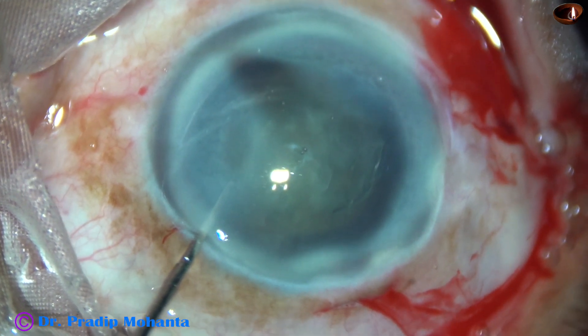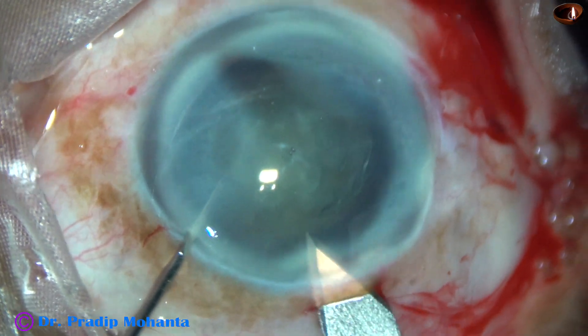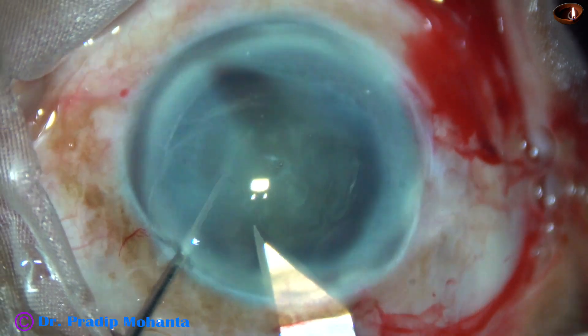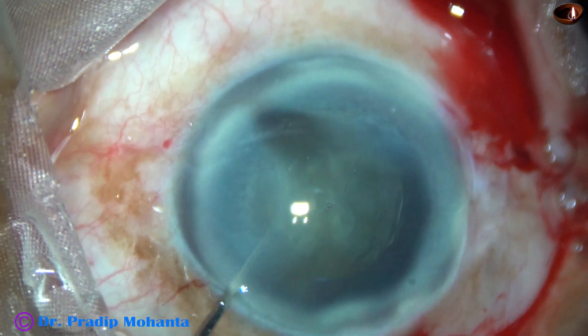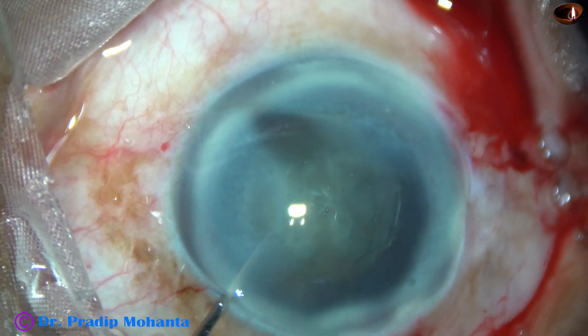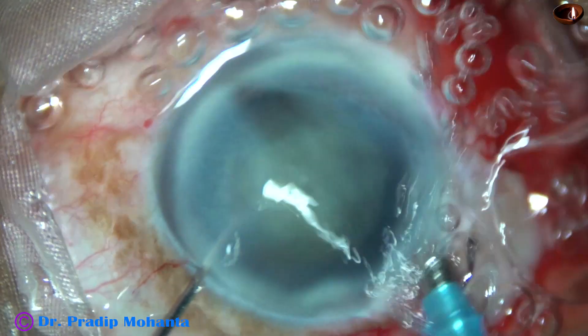And now is the time to introduce the phaco needle. I am enlarging the incision a little bit — making the incision about 3 mm so that the phaco needle goes easily into the anterior chamber.